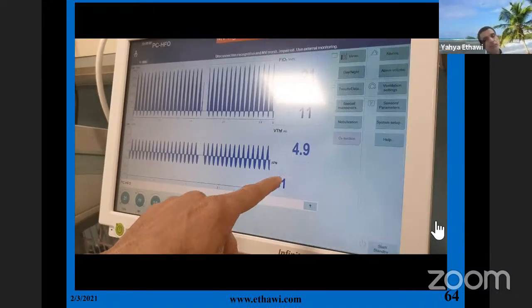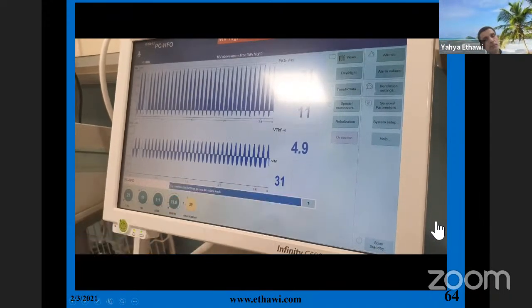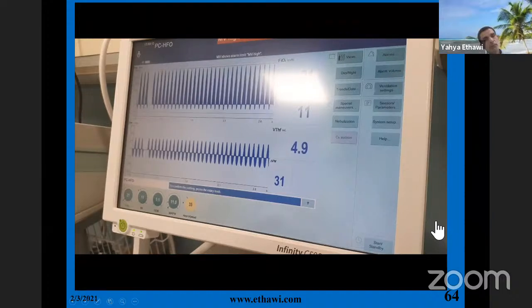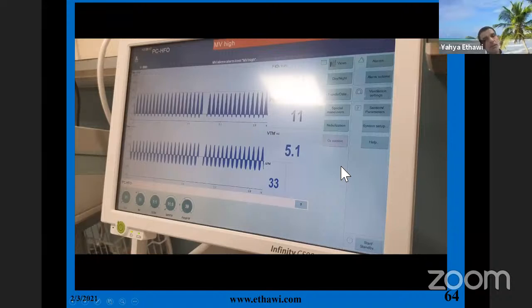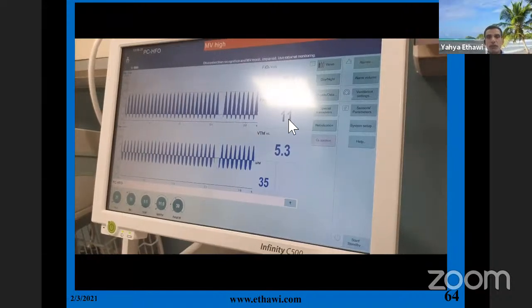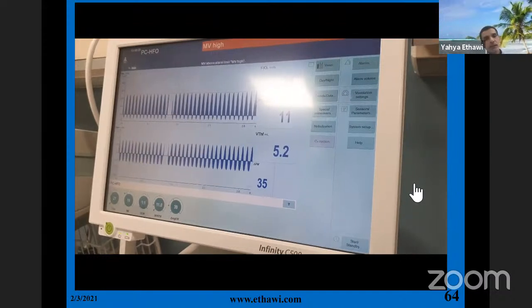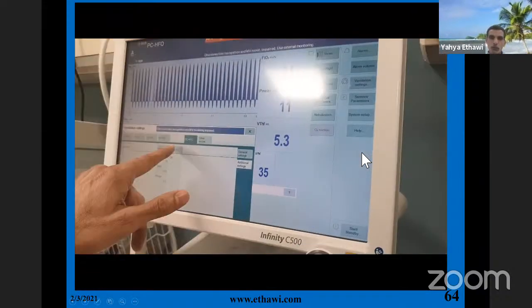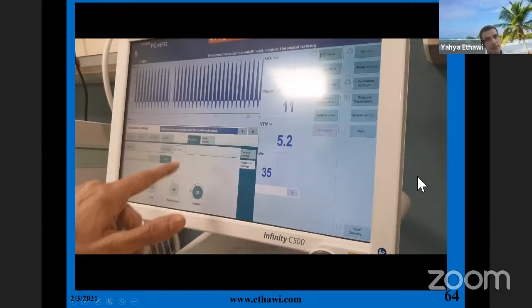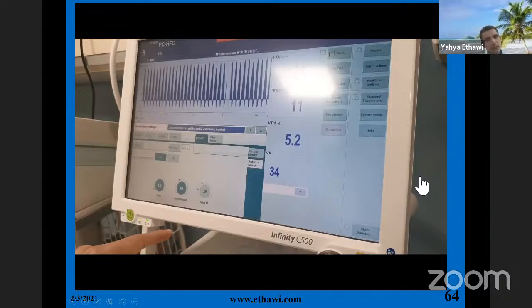The measured amplitude to achieve the tidal volume, so you can go up a little bit. I was thinking that the VG is working, but actually it is not working. Oh, we didn't add the high frequency. I was watching, what is the tidal volume? We didn't work. So now I'm adding the VG. Now, yes.